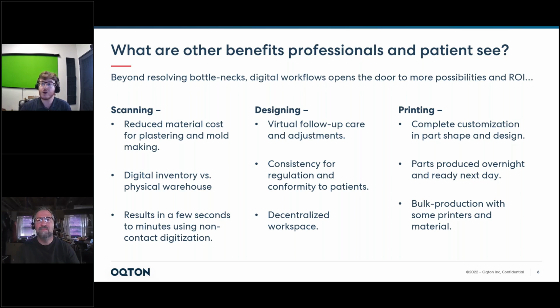And finally, going into the printing realm, just reemphasizing the complete customization of shapes and designs. It's the more possibilities that you can assist your customers with, and objects that can actually be made. If you've ever seen printers in the past 10 years, they are just rapidly advancing with more materials, and this again allows more access to parts that can be made.